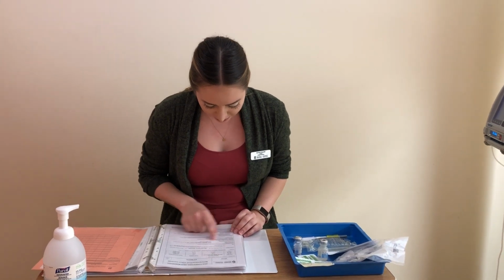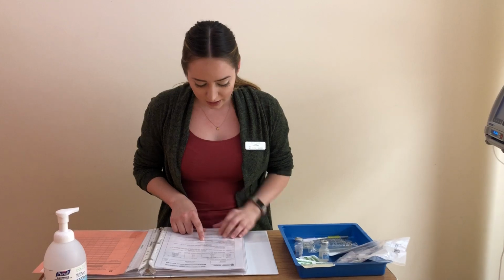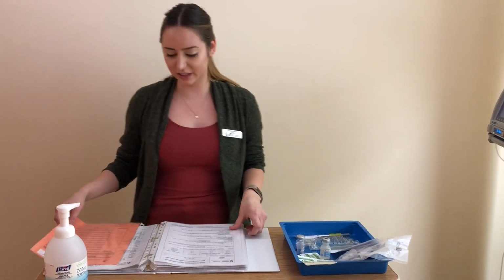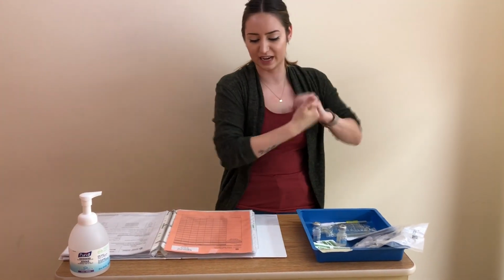Okay, anything else on the... So it's compatible with normal saline, which I know is what she's running right now. Okay, so we're good there. I'm going to perform hand hygiene before I gather my supplies.